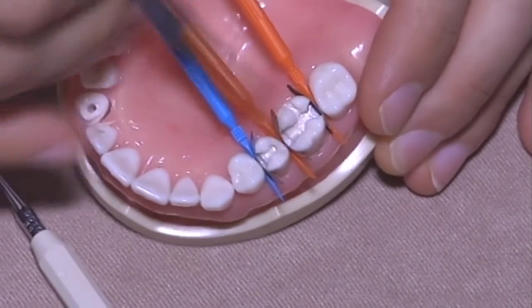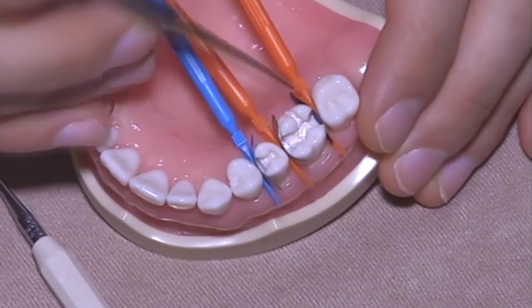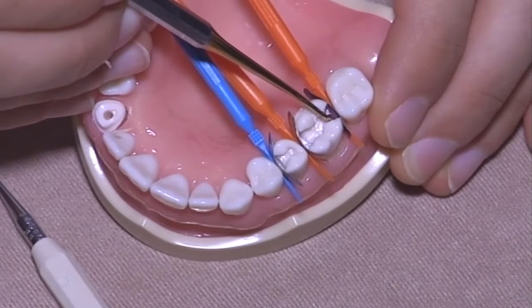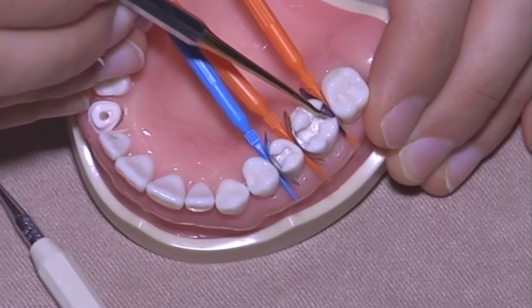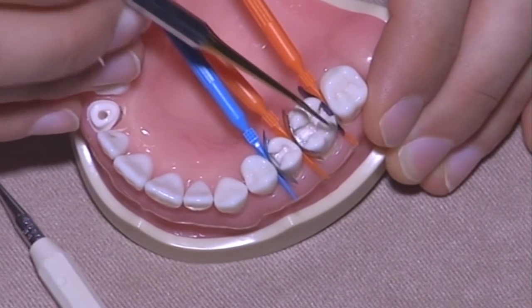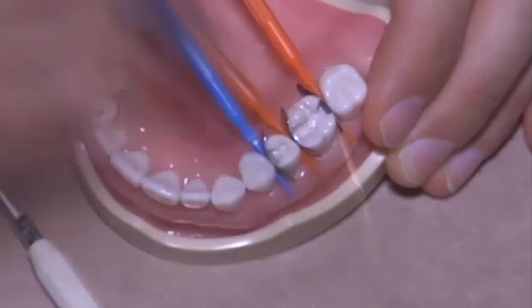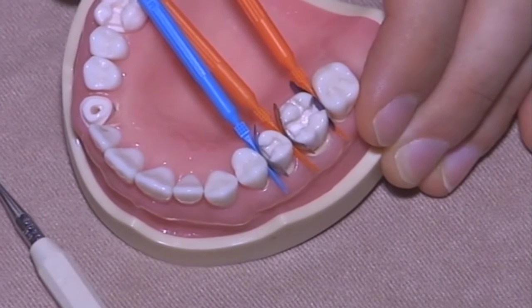So down there. Once you place the matrix and once you place the wedge, before placing the ring, you just have to check that you do not have space here in between the cervical ridge of the cavity and the interproximal matrix. And then that your matrix must be stable. So if you touch it, it moves here, but it doesn't rotate and it doesn't move in vestibular or palatal directions.